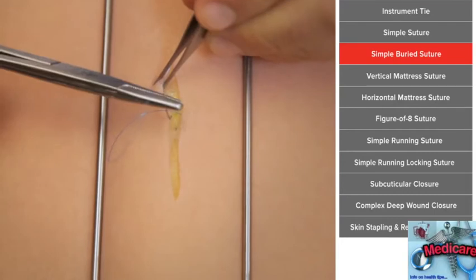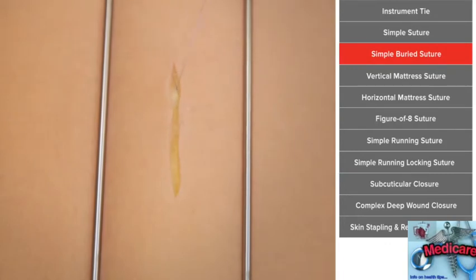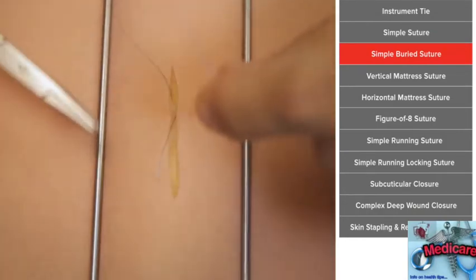So you need to get deep, grab some of that deep dermis, which in this case is that little piece of mesh, and make sure you're entering the same place where you exited on the other side. So just as superficial as you are on one side, you must be superficial on the other side, or else your skin edges will be uneven.